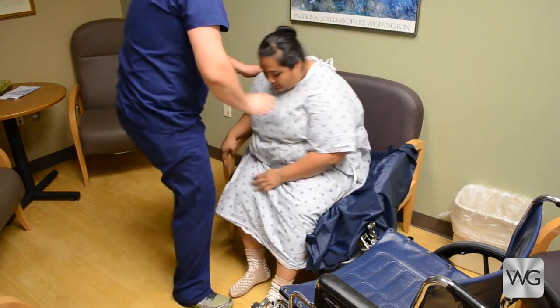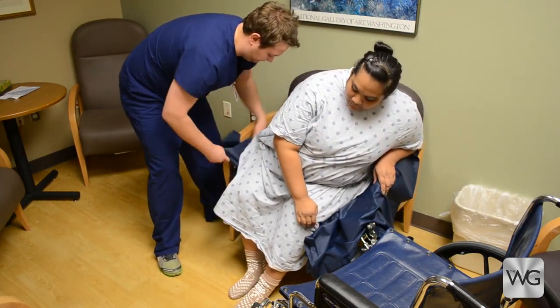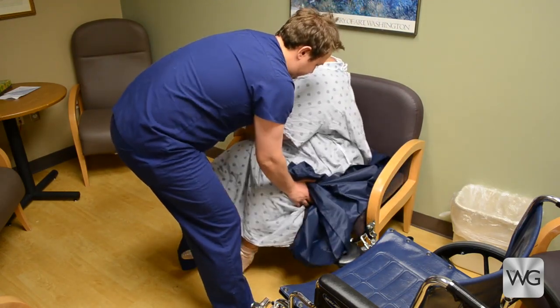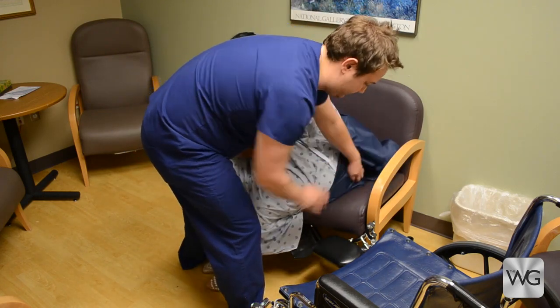The patient is instructed to lean from side to side while the caregiver places a folded slide sheet under the patient's bottom and thighs. The caregiver will assist the patient to scoot forward in the chair and turn her legs to the side, away from the wheelchair.